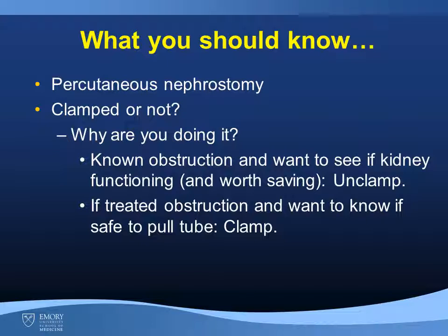But if there is a treated obstruction and the urologist wants to know if it's safe to pull the nephrostomy tube, then you want to clamp the tube, because that will best simulate what happens when the nephrostomy tube is pulled.